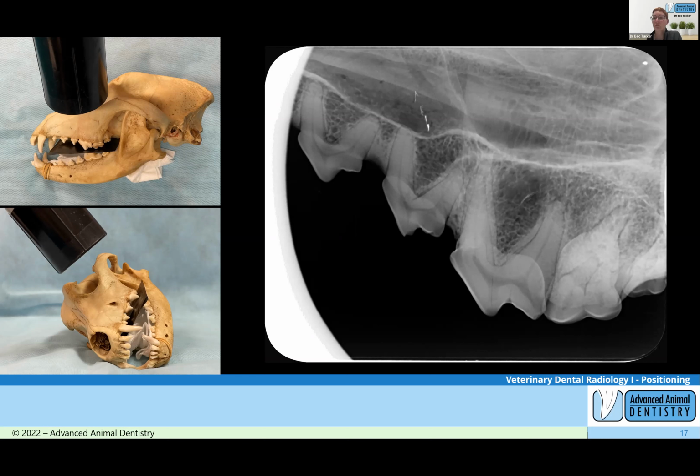And it's really helpful for workflow. We can get them anesthetized on whatever side we want to start on, and have that side radiographed in a matter of 4 or 5 minutes, without rolling and manipulating the patient to get that series of x-rays. So we want to talk about how we do that a little bit today. Hopefully that might be beneficial and help with workflow as well.